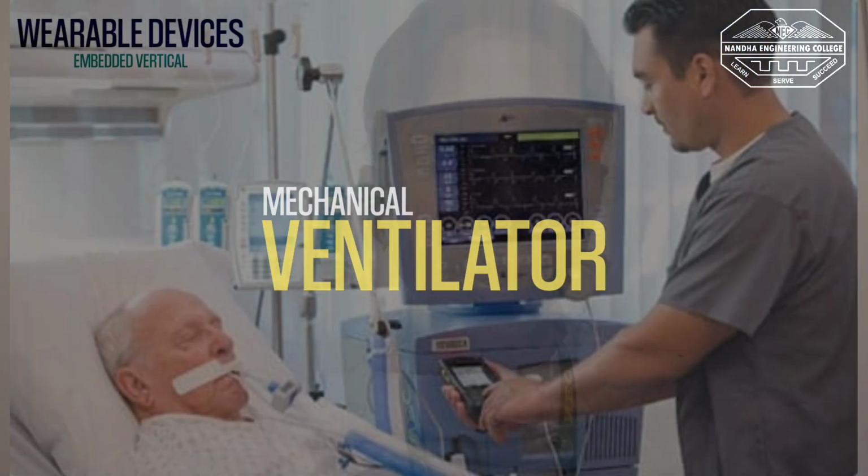Hello everyone, I'm going to talk about a life-saving device that beautifully blends biomedical science with electronics and embedded systems, the mechanical ventilator. A ventilator is an electromechanical system designed to support or replace spontaneous breathing by delivering controlled airflow to the patient's lungs. It is a real-time embedded system that integrates sensors, actuators, microcontrollers, and control algorithms.